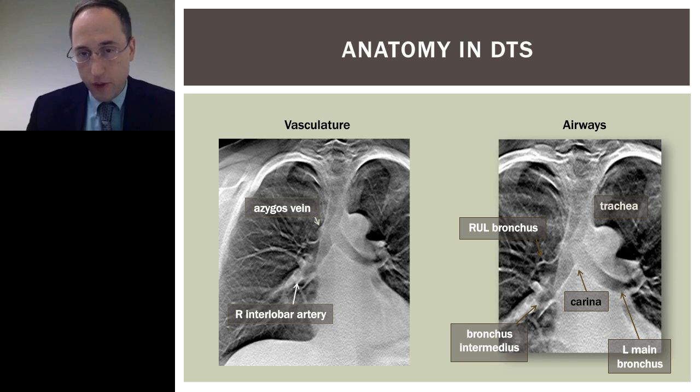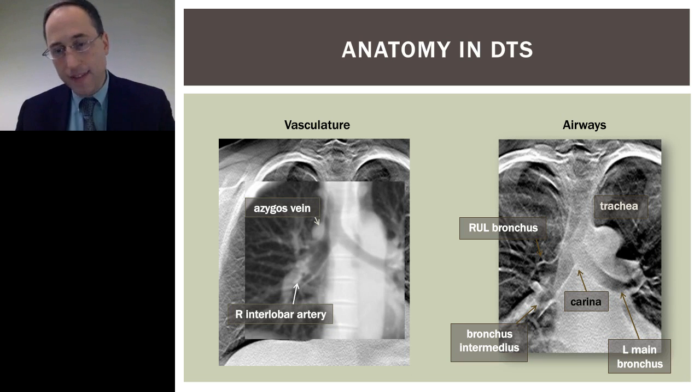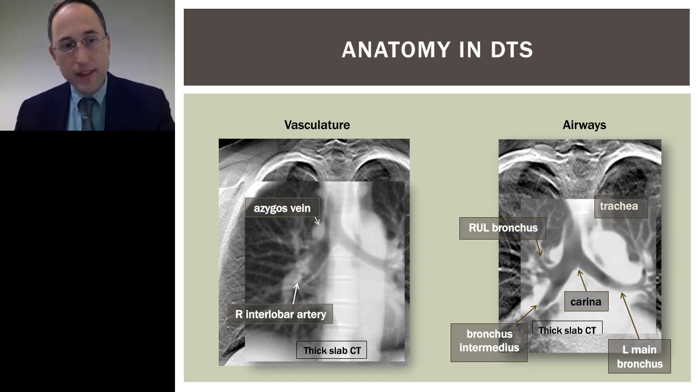Okay, and I'm going to go ahead and overlay a thick slab CT that is showing this. Okay, so that's information from a CT that I've overlaid on top of the tomosynthesis image to give you a sense of what we're looking at.